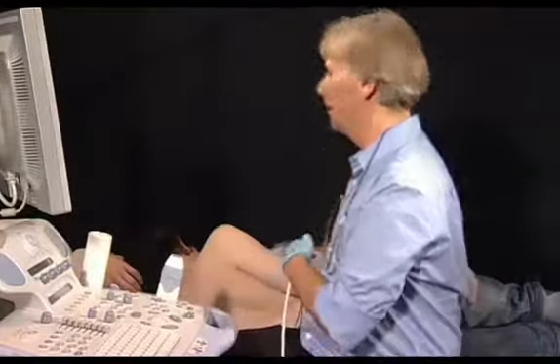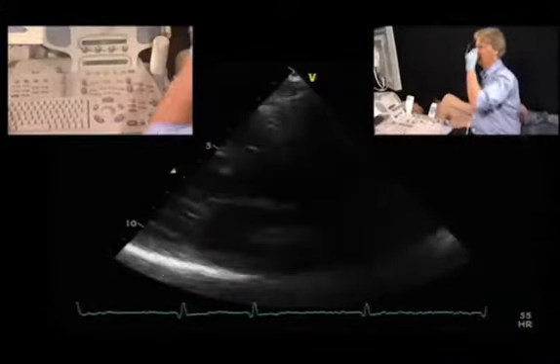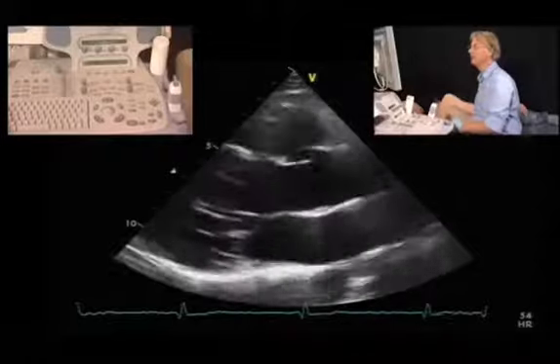In modern transducers, you can actually change the transducer frequency, and you can also change the mode of imaging from fundamental to harmonic imaging. I will show you now what happens if I modify the image frequency. Let us now start with this setting here.